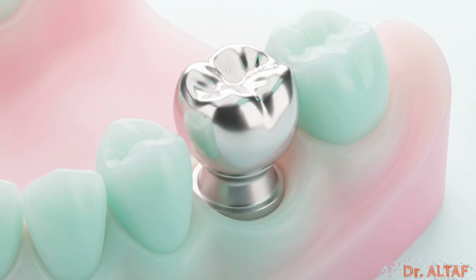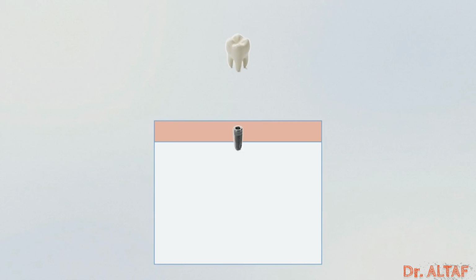Every successful implant procedure depends on a single absolute requirement: achieving tension-free passive fit. The final prosthesis must align perfectly with the implants without exerting any mechanical stress on the surrounding bone.